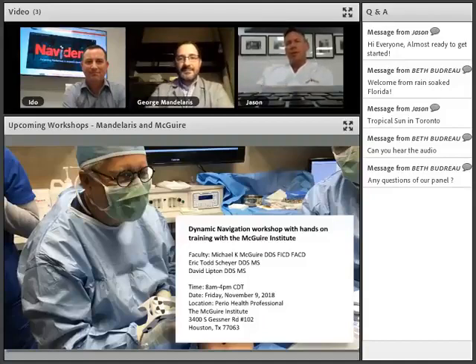So every one of these people has experience with the system, but it's in that sharing of what we do back and forth with each other that it's going to get better and better and better. And obviously we thank Luigi for creating a lot of that information in the study and continuing to do cases on a daily basis, as you are as well.